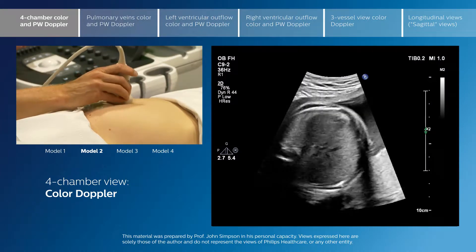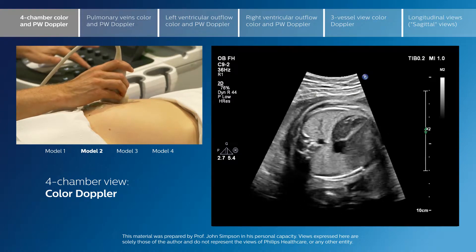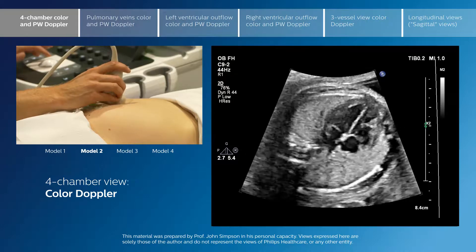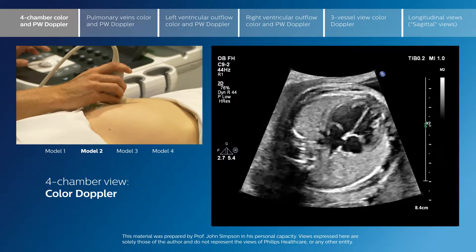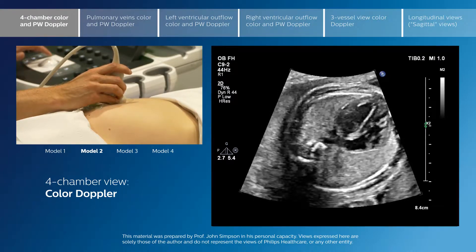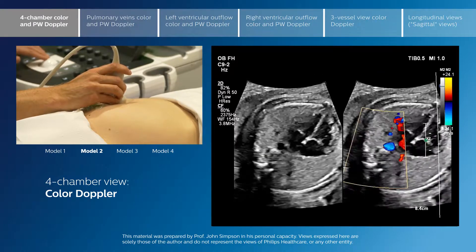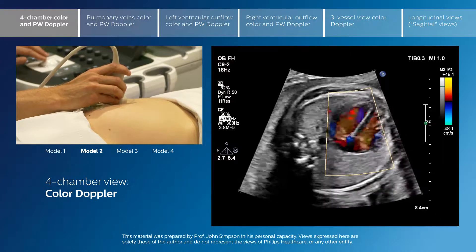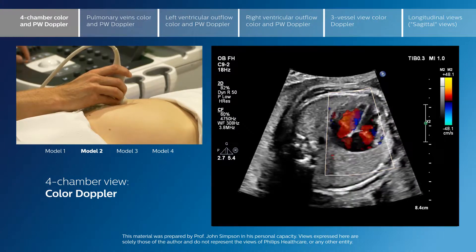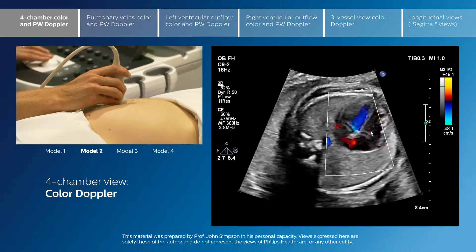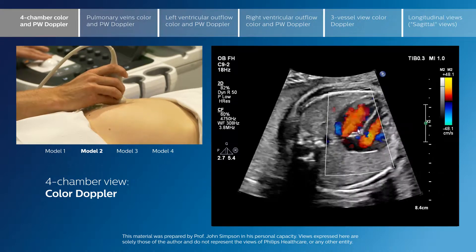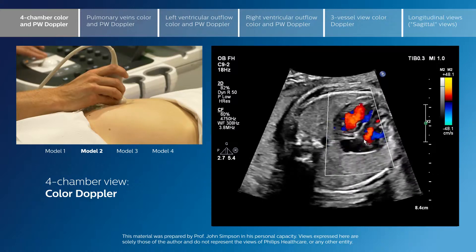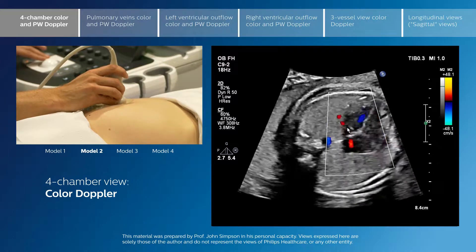Once the views of the heart are obtained in cross-section, the use of colour may be extremely helpful to confirm the flow into the heart and the flow in the great arteries. Here on the four-chamber view we see the symmetrical size of the left and right ventricles, the opening of the tricuspid valve, and flow into both the right and left ventricles. On the right we see unaliased flow in a broad jet from the right atrium to the right ventricle and from the left atrium to the left ventricle. We nicely see that there is nothing crossing the ventricular septum, and there is no evidence on colour flow of regurgitation of either the mitral or tricuspid valve.